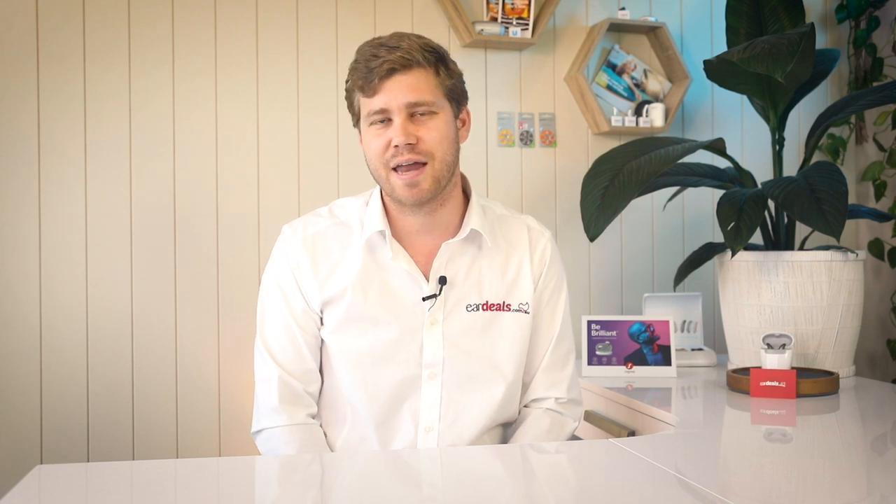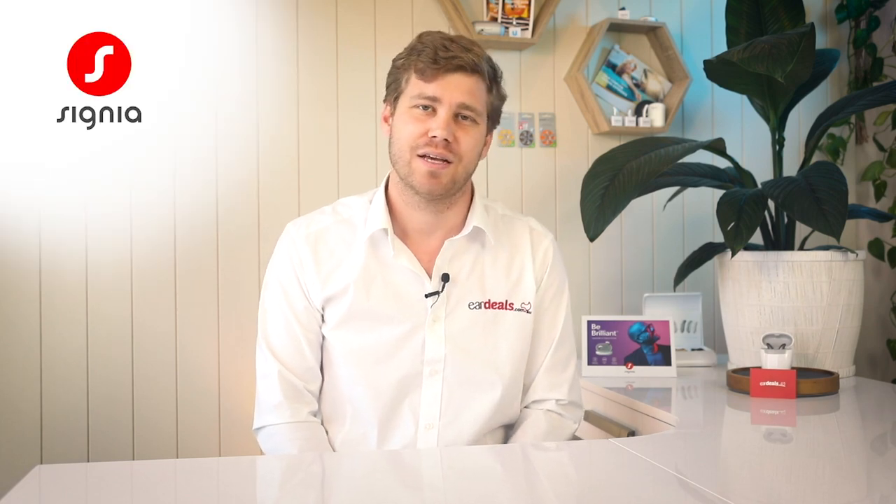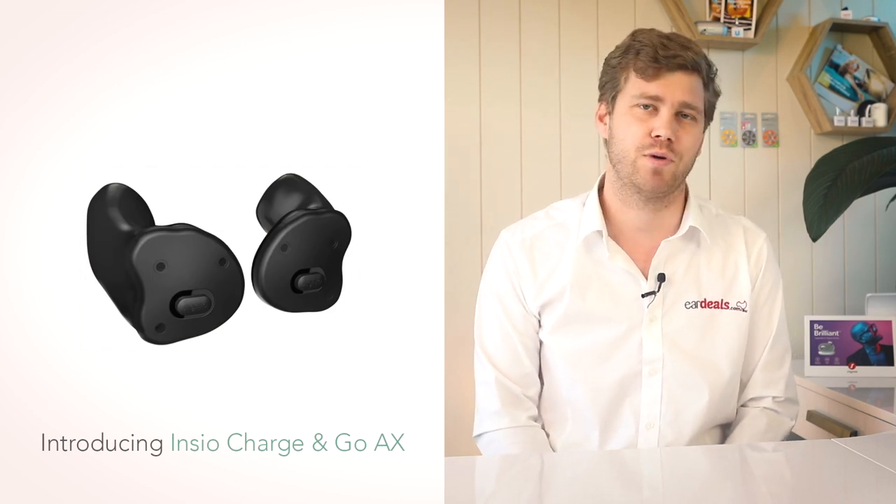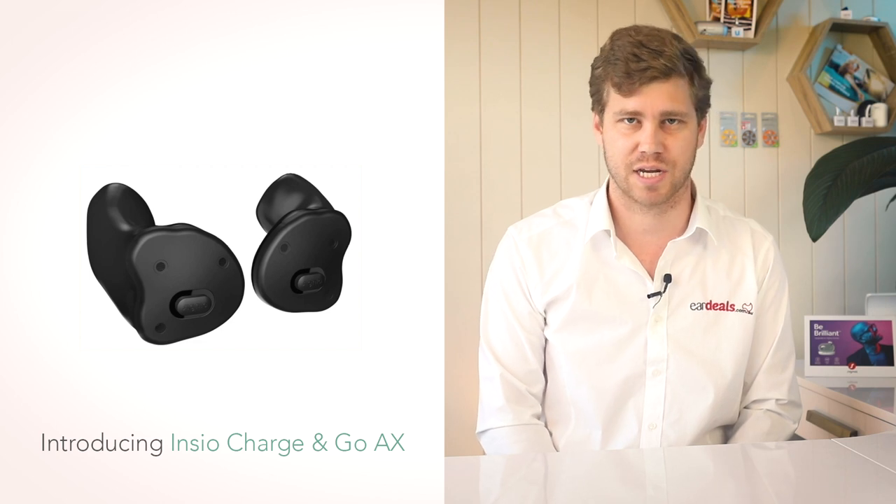Today we have an exciting announcement straight out of Germany from one of the largest brands globally, Signia. Signia is releasing a new Insio device, which is the name of their customised hearing aid.